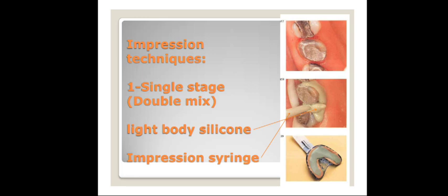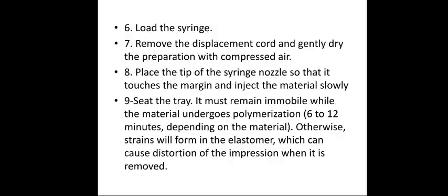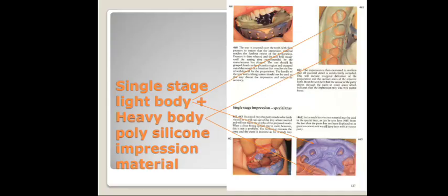Then the two consistencies and the two mixes set evenly at the same time. They will result in an impression like this. The area of fine details is reflected by the light body and the main body of the impression is constructed from the heavy body.